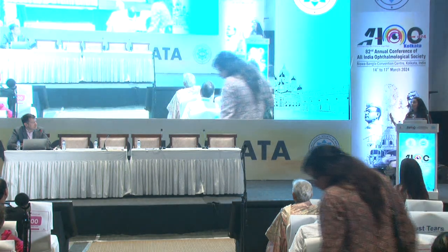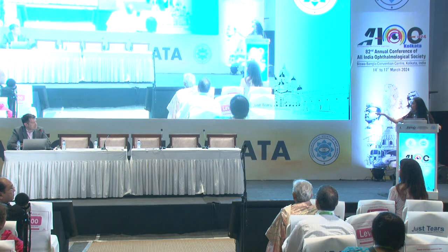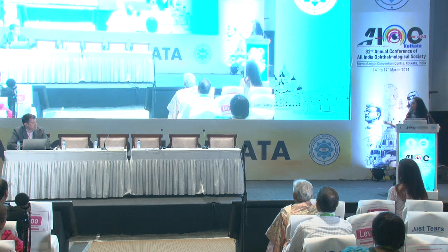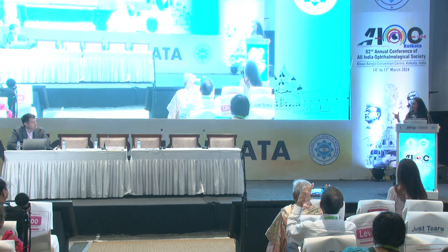The post-PK patients, yes. So I do them at the time of cataract surgery, and I do usually combine them with corneal compression sutures because I find that, at least the ones I'm doing these on, the amount of astigmatism they have does not completely get corrected by your nomogram. And I always over-correct with the sutures. And that way you can always take them out. So I use my sutures as sort of the adjustment.